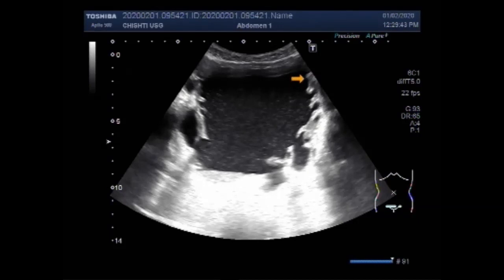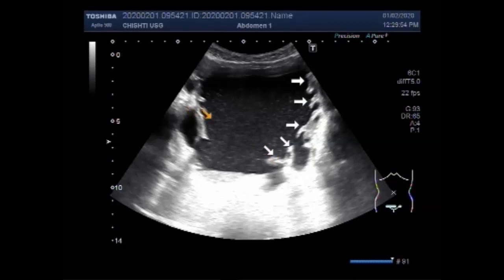You can see these are the trabeculi on the right lateral wall of the urinary bladder. And these are the trabeculi seen on the left lateral wall of the urinary bladder.